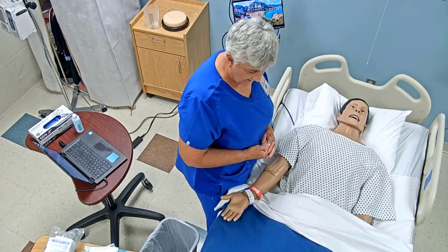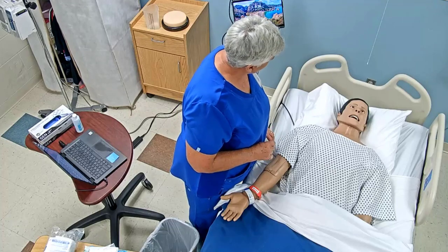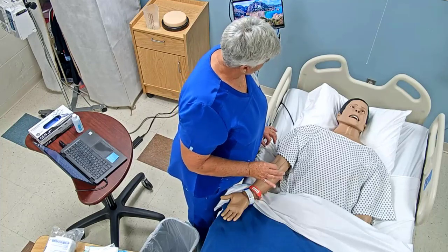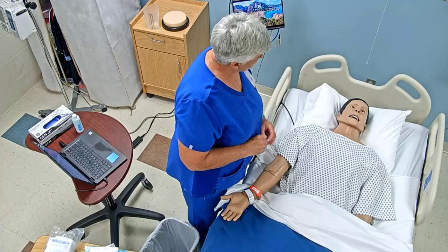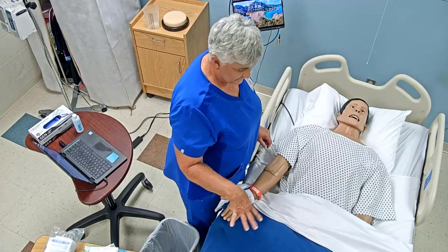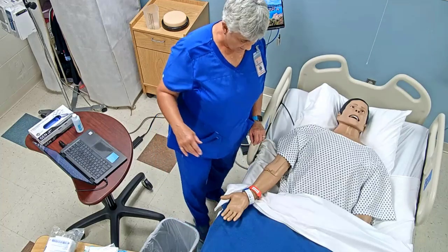When I get ready to do that, I'll have you take a slow, deep breath. As soon as we drain the urine out of your bladder, we're going to take it out slowly, and then do a little bit more pericare for you.